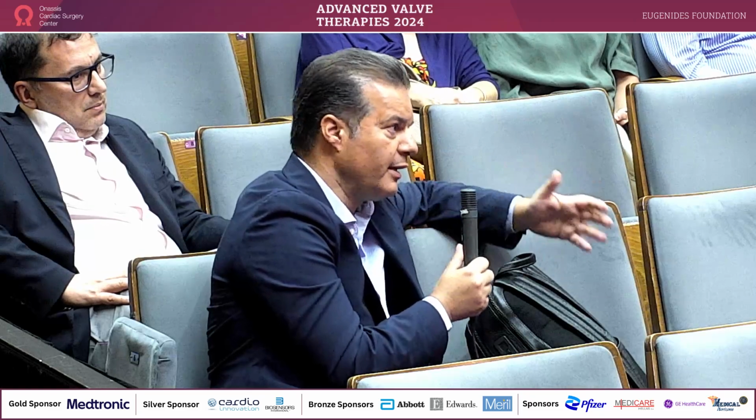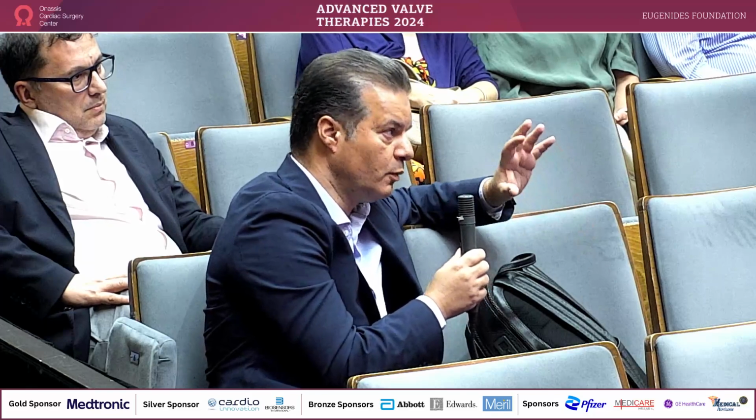Vlasis? Yes, if we have a minute. Yes, go ahead. Congratulations, Theo. We've been in this together, and Professor Vavuranakis, for some time now. One of the most difficult access points to close a mitral leak is the P2 area, 6 o'clock. And we've struggled sometimes transseptally. The other day we used your technique with the AV loop, and it works very well. It gives you tremendous support. Theo taught us how to do it, and we're grateful for that. It's one of the things that actually works a lot.